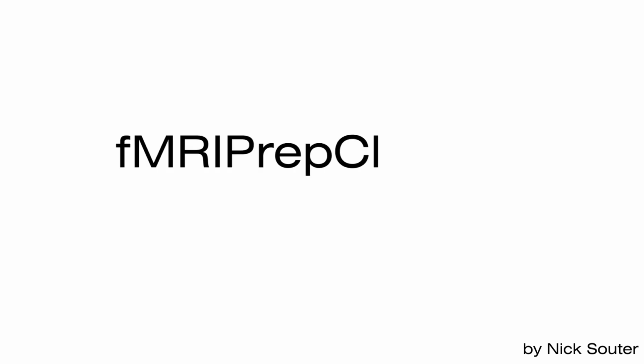Hi everyone, and welcome to this brief introduction to the tool fMRIPrepCleanup. Here I'll give a brief overview of why this tool was created and how it works.